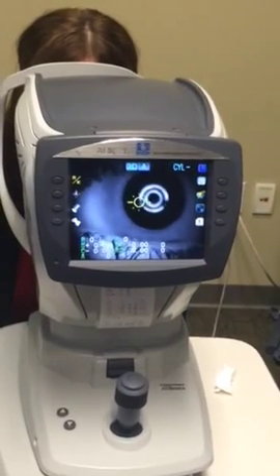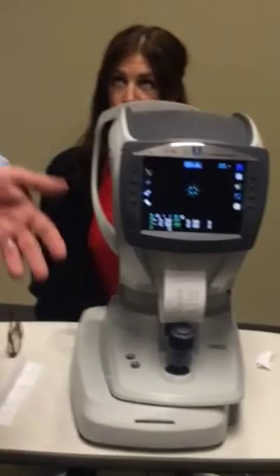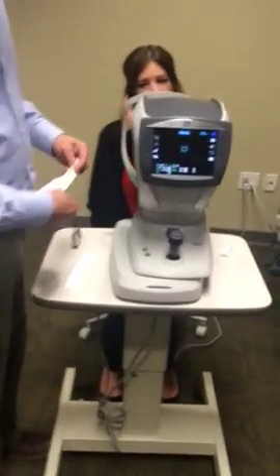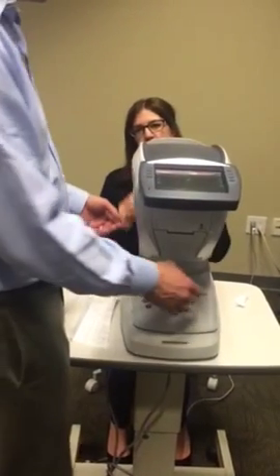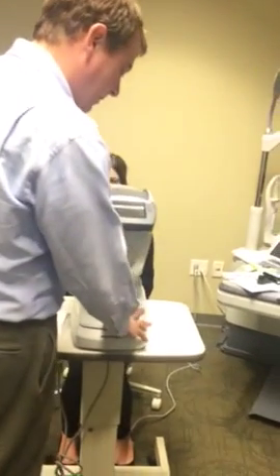It automatically prints. If it doesn't automatically print, that means you have KM question mark on one of the eyes. The screen tilts up in case you're in a tight space and standing. It's also very helpful for a patient with drooping lids, so if you have to reach across and hold the lid up.